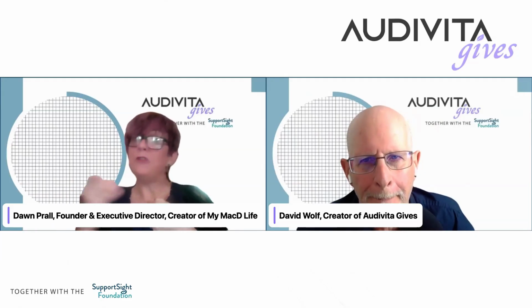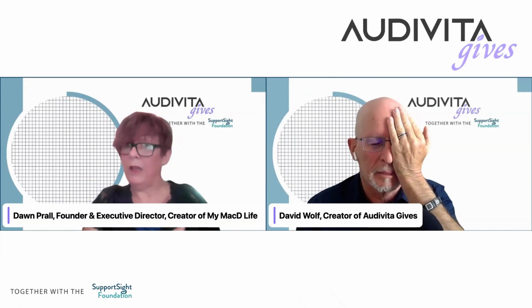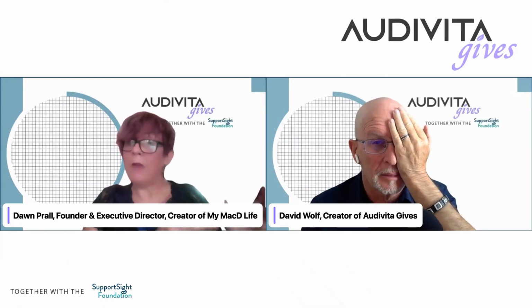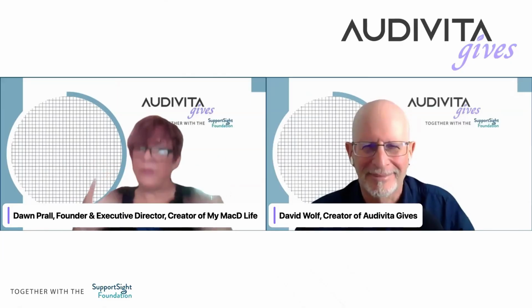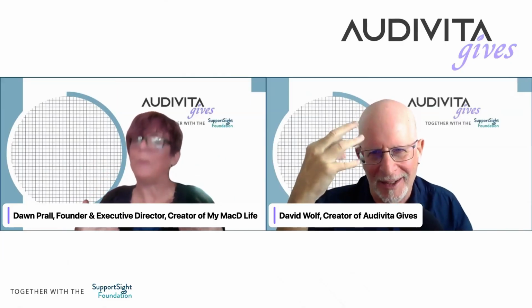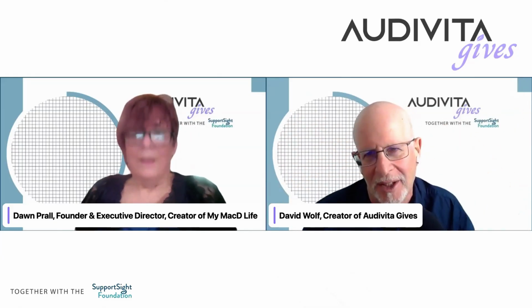Okay. Then you do the same thing with the second eye. Same thing. But I recommend closing your eyes in between, because you have to give your brain a chance to get rid of the image on the retina. There's like an echo. Those of us who look at things, you close your eyes and then there's like an echo of it. So you want to get rid of that.